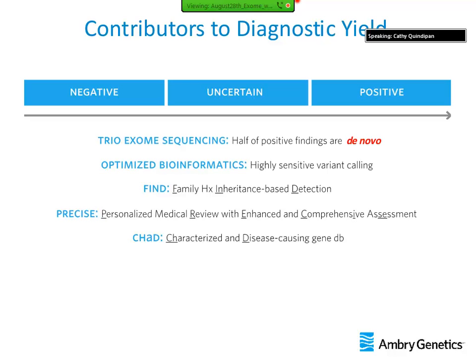And we have an internalized database called CHAD, which stands for the Characterized and Disease-causing Gene Database. Our internal database is curated weekly from publications, and that helps us keep up to date and improve our bioinformatics internally. And if we're not seeing alterations on characterized genes, we're automatically reflexing to novel gene variant analysis for every exome case where an alteration is not found on a characterized gene.